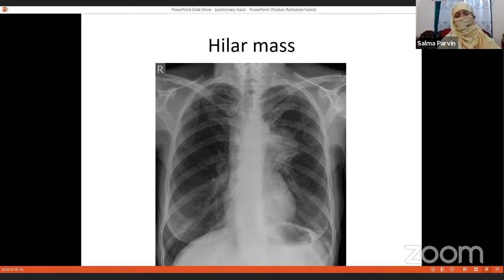What is mediastinal infiltration? It is the hilar invasion leading to the involvement of other structures in the mediastinum, which causes palsy of the phrenic nerve on that side. So this mass we are seeing here outside the cardiac and mediastinal shadow is really a stage 4 malignancy already, as there is phrenic nerve palsy, meaning that there is mediastinal infiltration. The other thing I want to mention, I must show the slide later, inshallah, is that this phrenic nerve palsy is one presentation type. Another is hoarseness of voice.